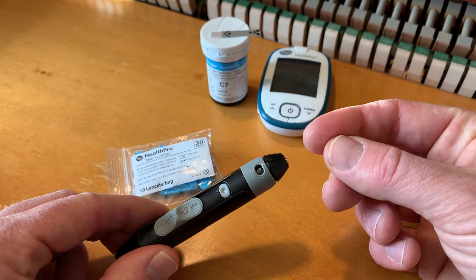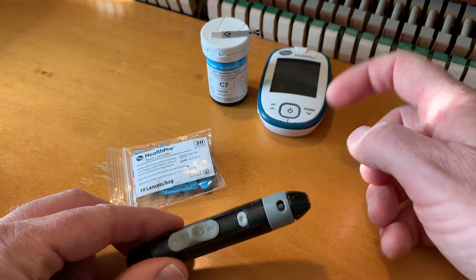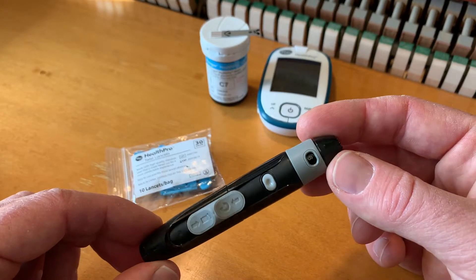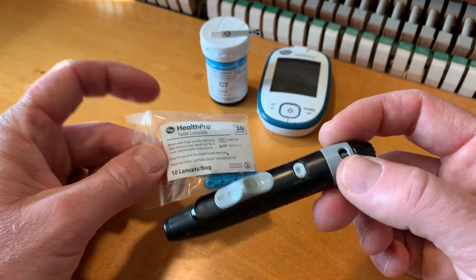It pricks your finger to create a little droplet of blood that you can then put on this little test strip that goes into the monitor to give you the proper reading. But this little lancer can be a little bit hard to understand exactly how it works, so I want to show you what to do and how to load this thing.